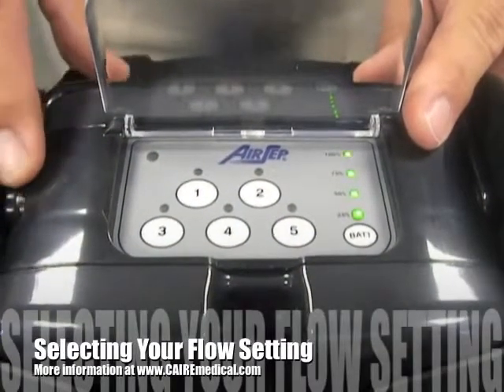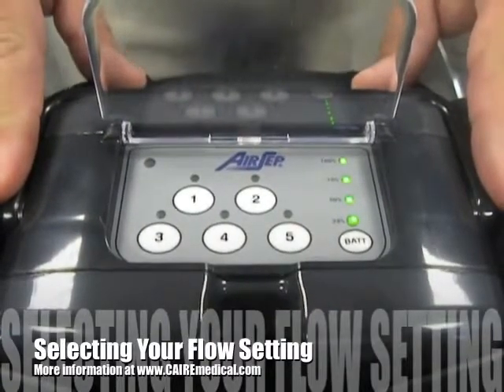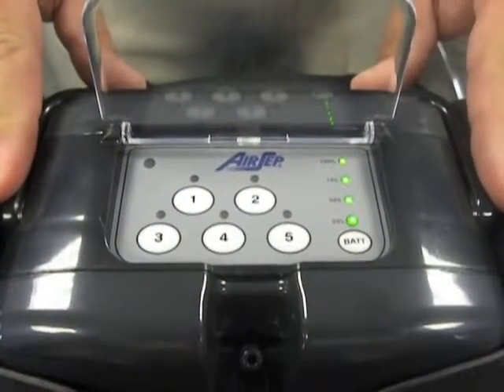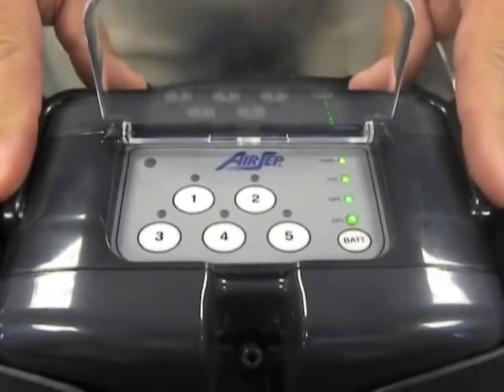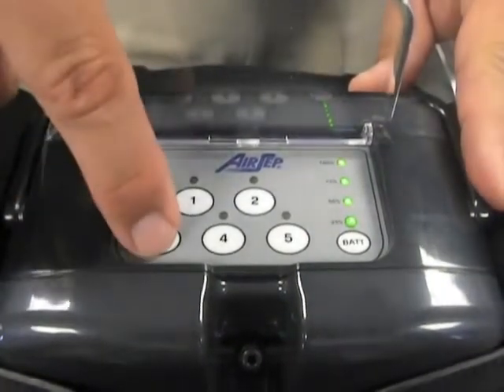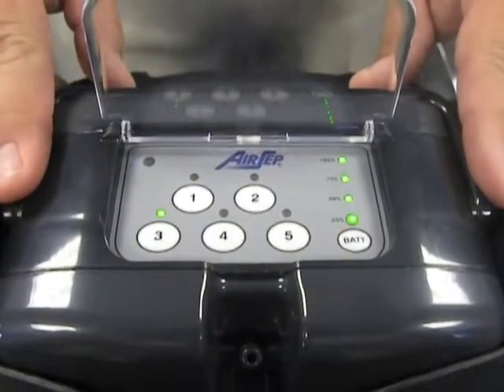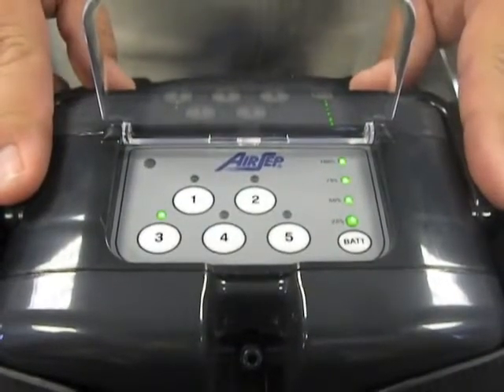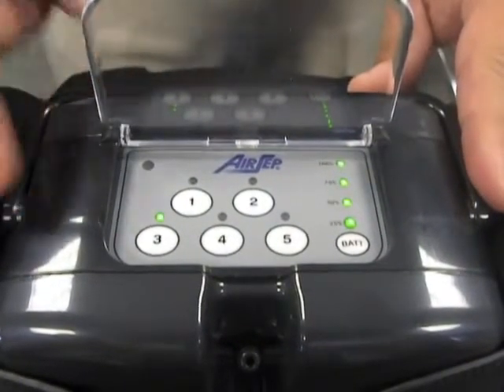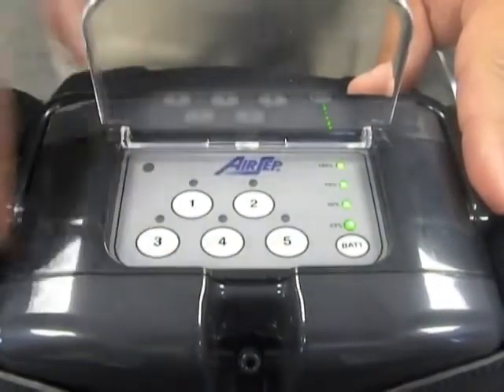In addition to the battery gauge, you will also see 5 different flow settings. This allows the patient to select the flow that has been prescribed to them by their physician. If a patient's prescription is a setting of 3, they would simply depress setting 3 to turn the device on, which will now put the FreeStyle 5 into pulse mode. When the patient is completed use of the FreeStyle, they would simply depress the button once again to shut the device off.